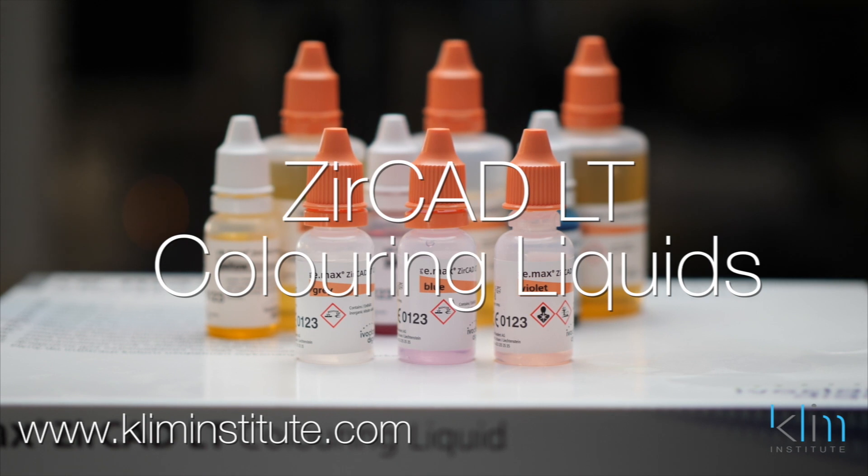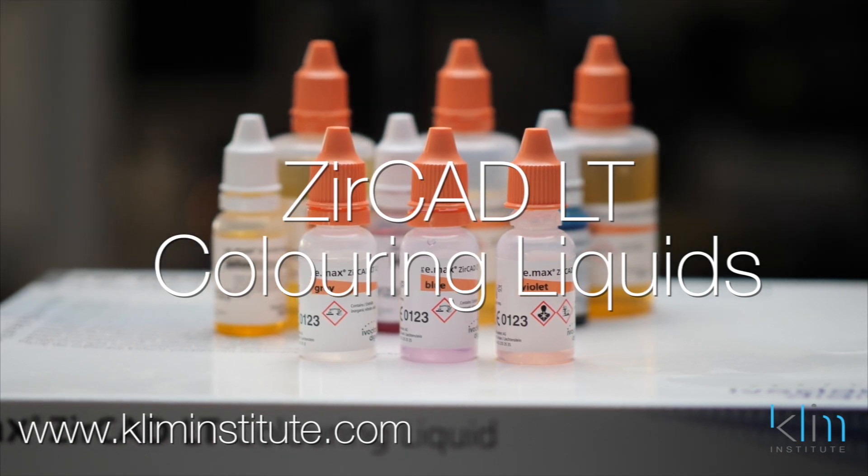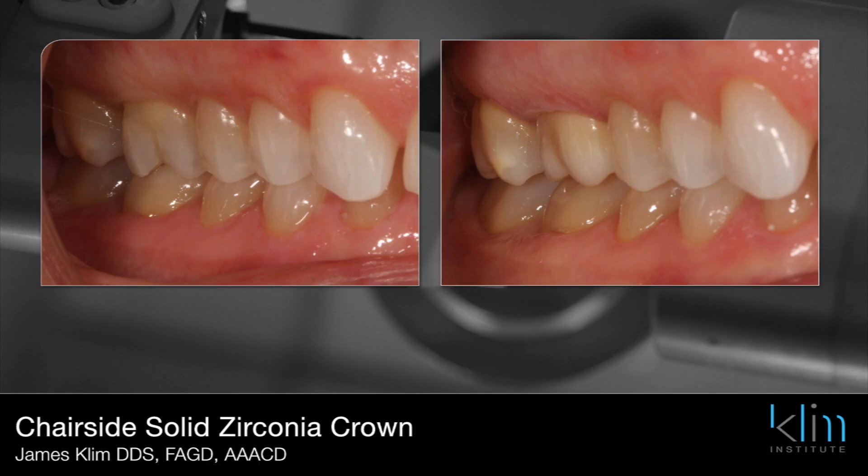There are a number of videos on this site that will provide application techniques for single units and bridges. Enjoy coloring in your zirconia LT. Though we have quite a few zirconias to choose from today with multi-effects and more translucent options, when I want something really strong, when I need a thin margin, a thin restoration, or a long-span bridge, Zircad LT is my choice. And to make that work for me — blend the best I can, avoid visual tension — is to use these coloring liquids. I hope you enjoy the process; I know you will. I actually kind of like it — it's really easy to do.